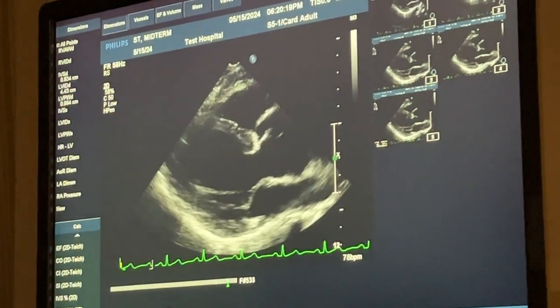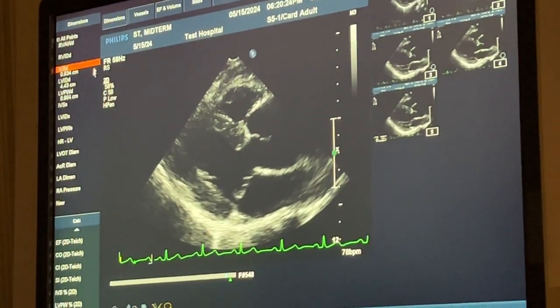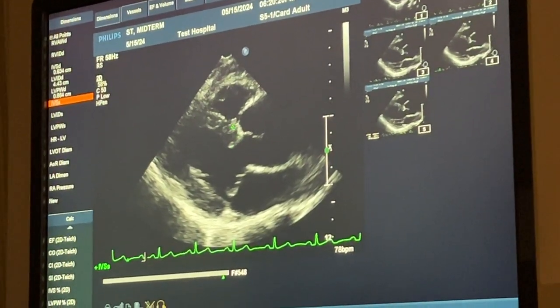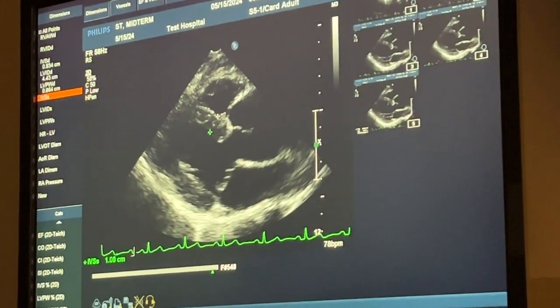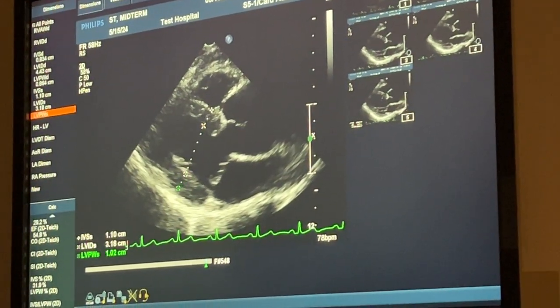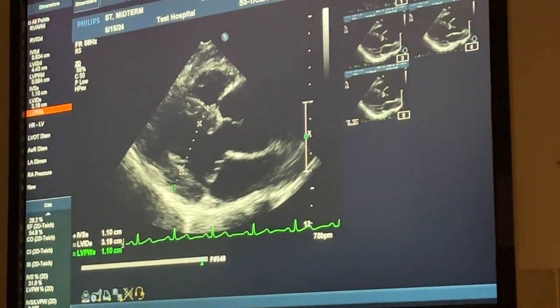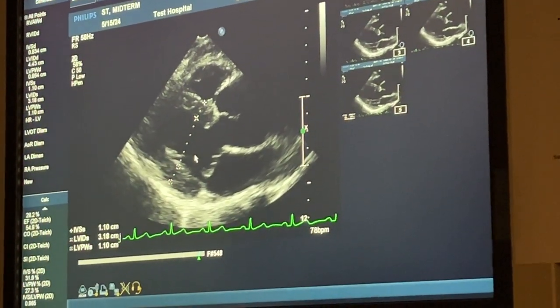And then I'm gonna scroll forward, so same cycle for end systole. You're gonna measure the same thing. So calc package, interventricular septum, internal dimension, posterior wall. Now what else do we measure here? Remember?